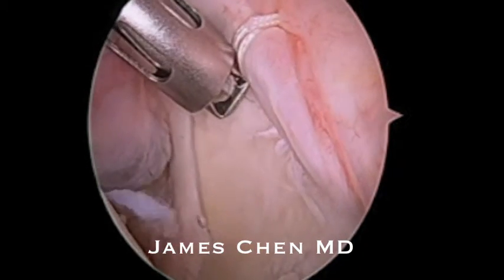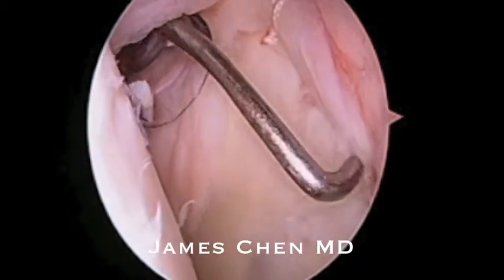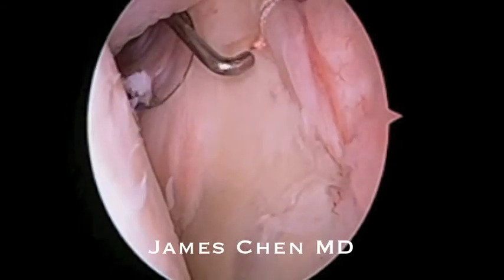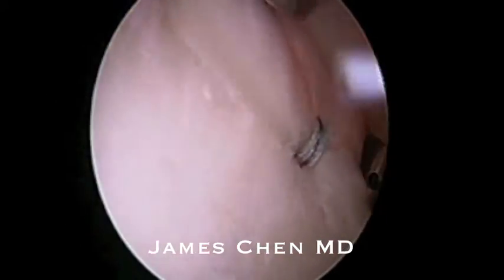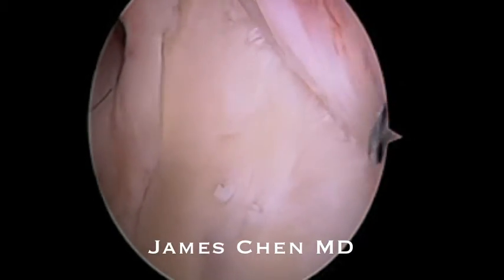I will then follow with a suture cutter. Now I am probing the superior labrum and you can see it is now repaired. I am looking through the anterior portal to confirm the posterior labrum is secure, and here is the completed SLAP repair.